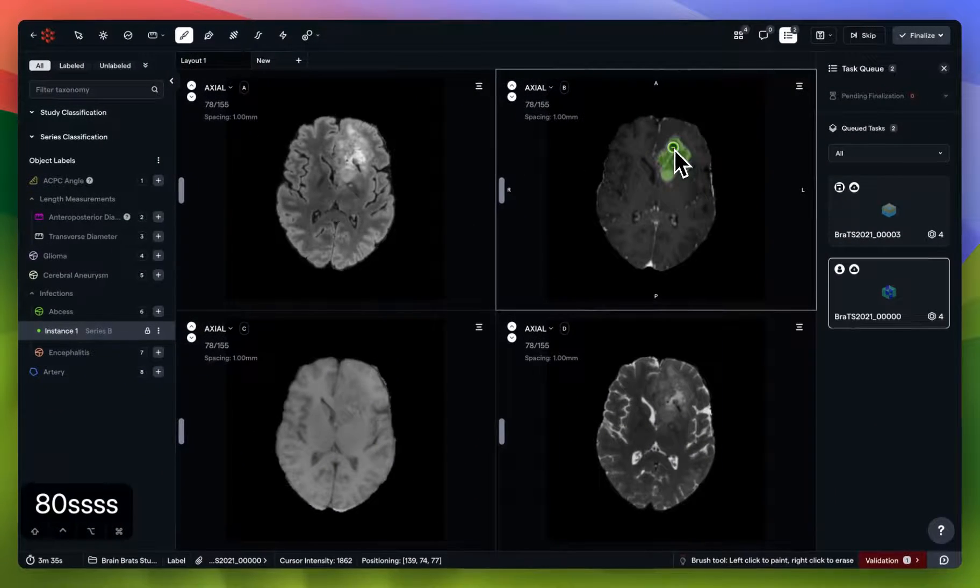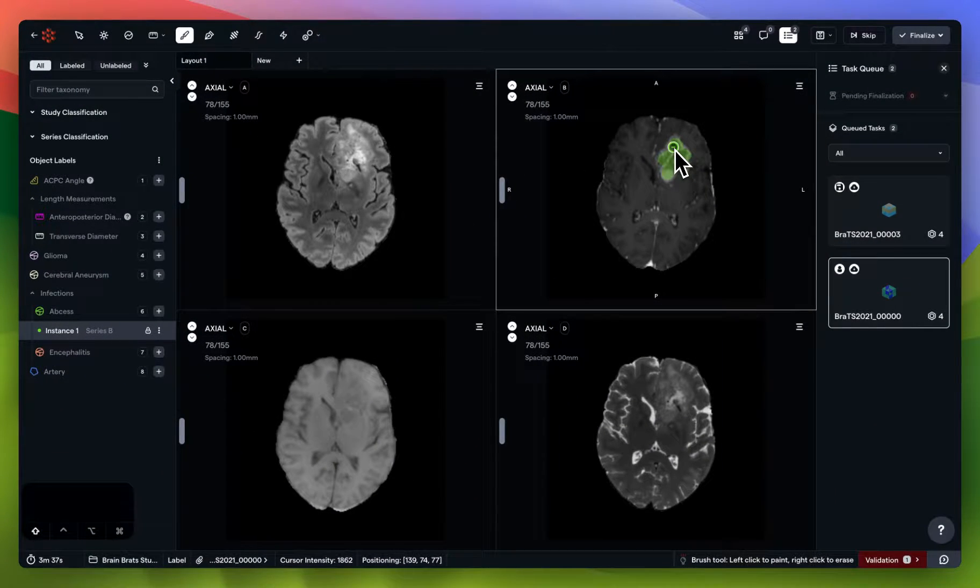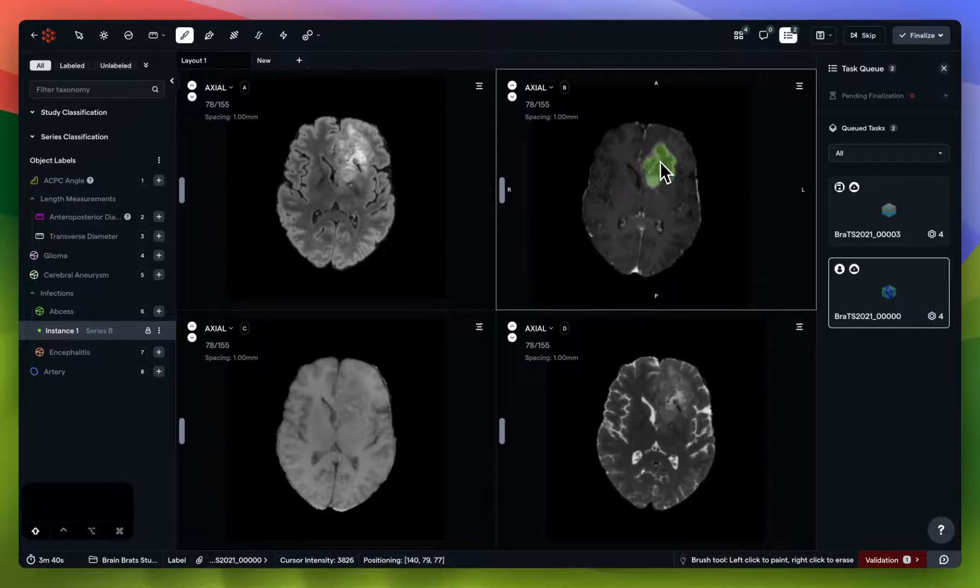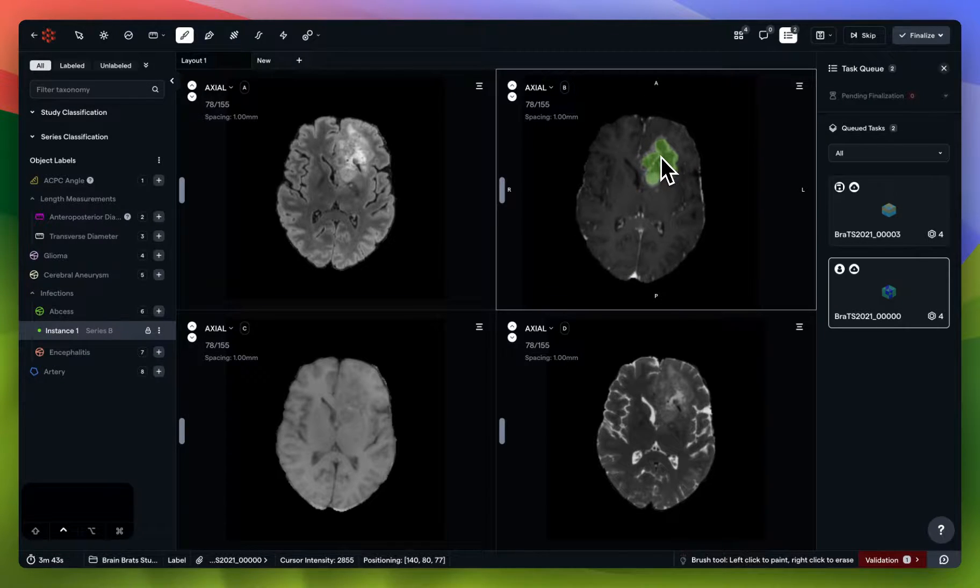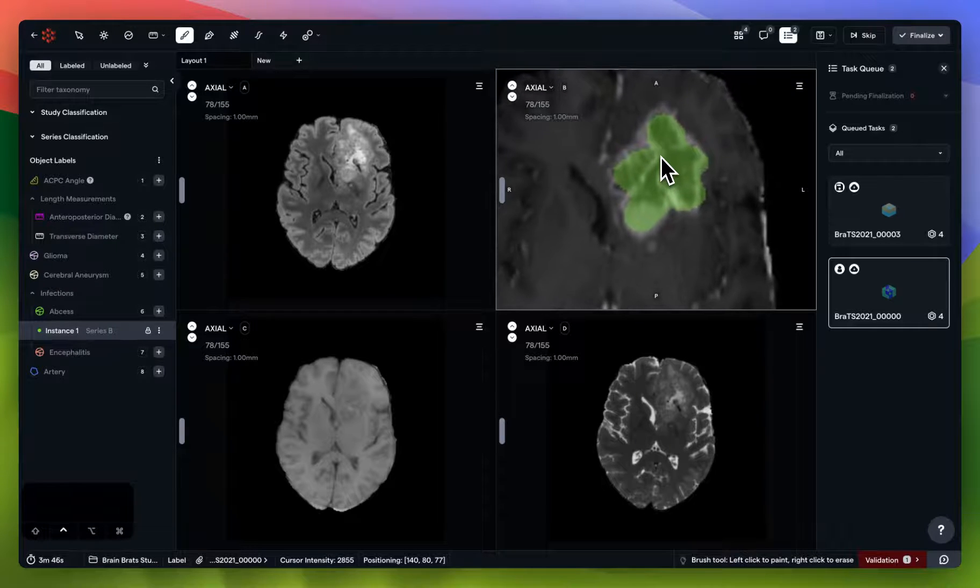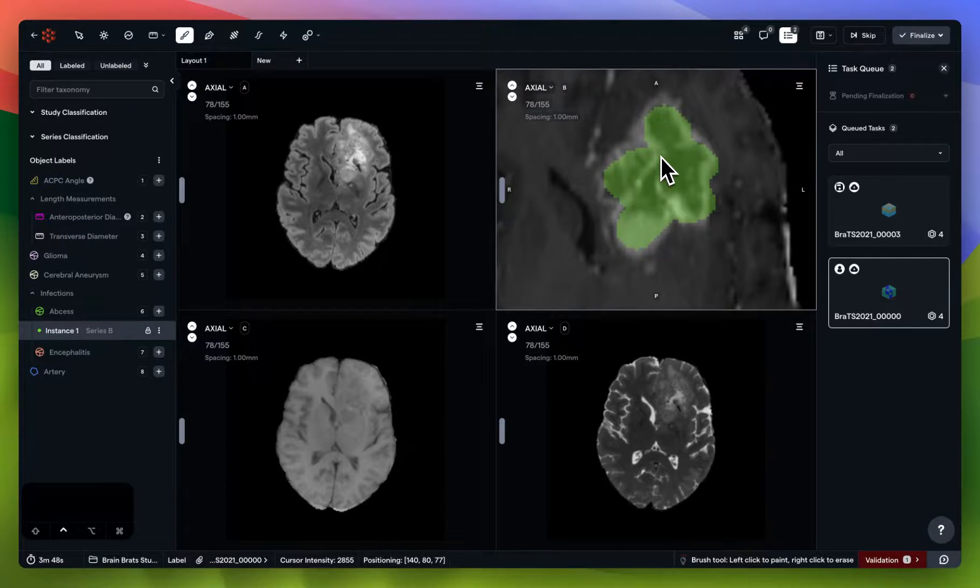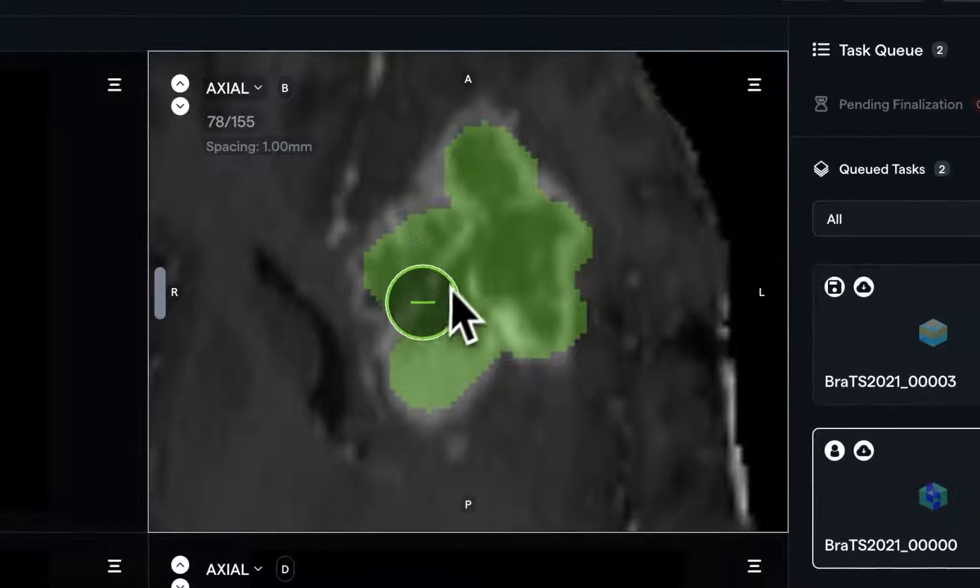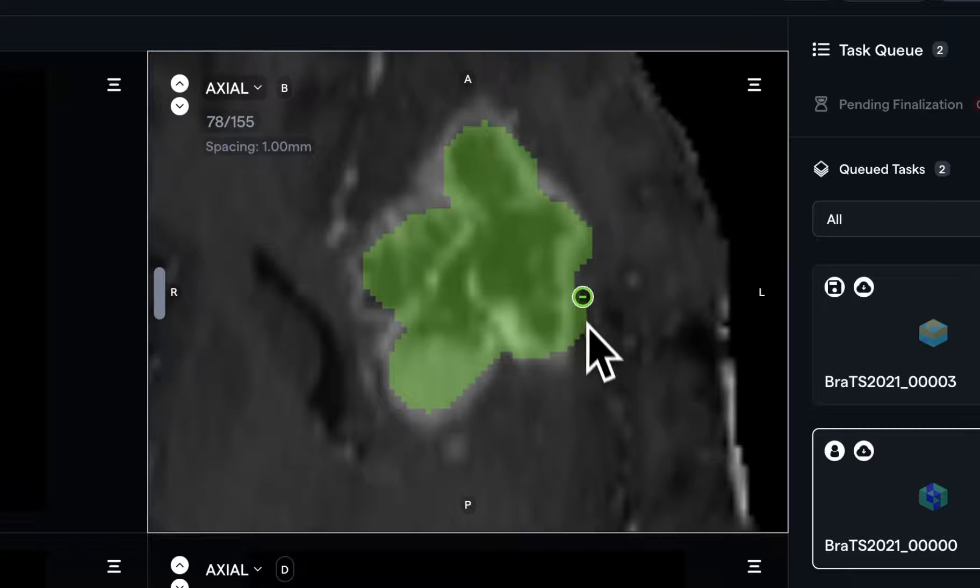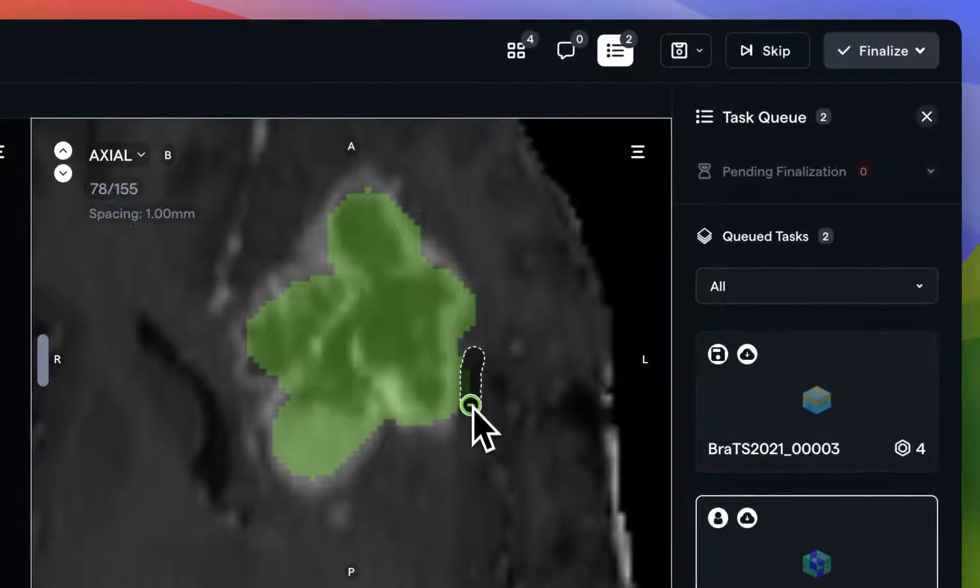Maybe I want to get in closer. I can use Shift-click to pan, Control-and-mouse scroll to zoom in, and we can now even start to see the pixelation on the segmentation mask. So, if I feel I've gone outside the borders, as I've done here, all I have to do is right-click to erase.